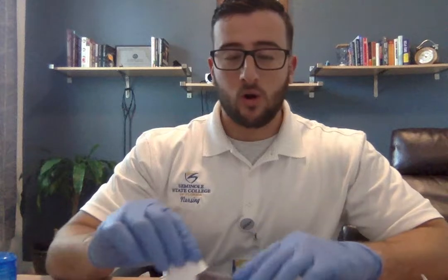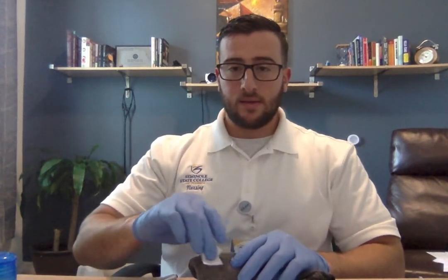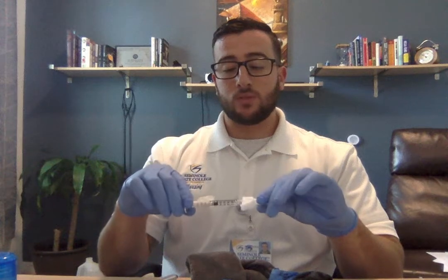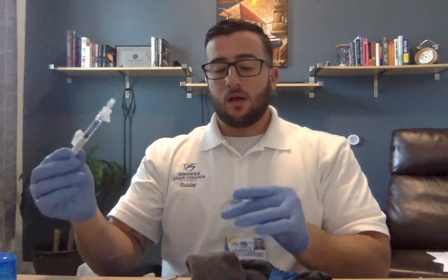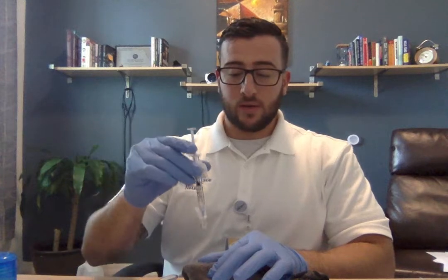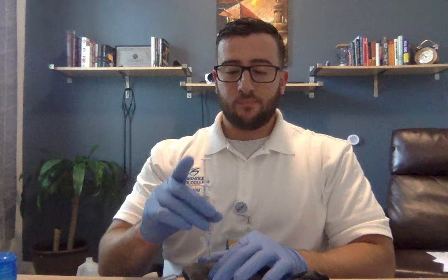I'm going to get my alcohol pad and clean from the inside going out. I'm going to let the deltoid dry. Then I am going to uncap my syringe. Using my non-dominant hand, I'm going to place my fingers about 1 to 1.5 inches apart, separating the skin. Then I'm going to drop this in like a dart, at a 90-degree angle.